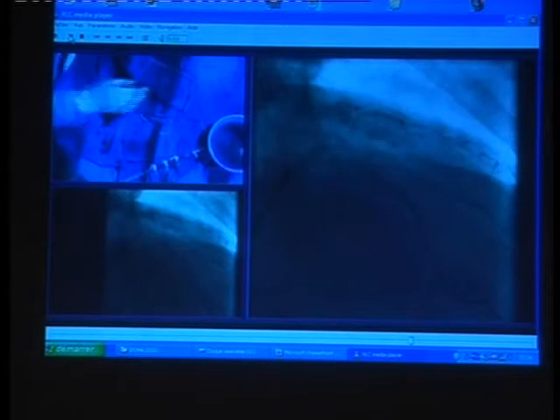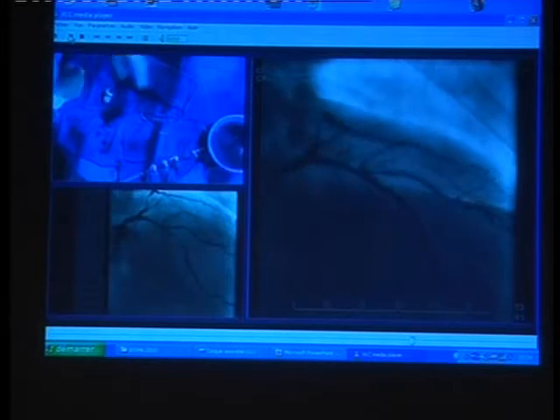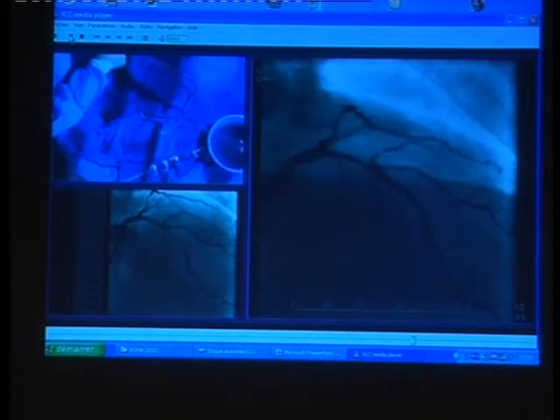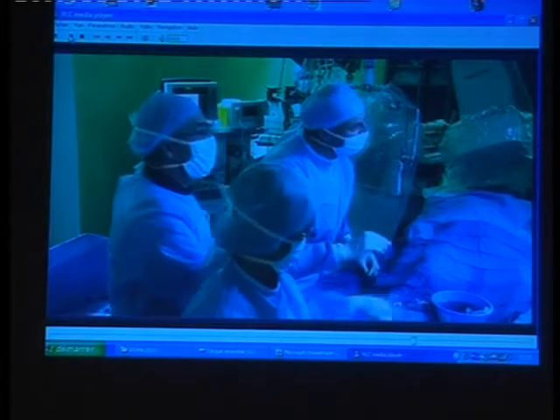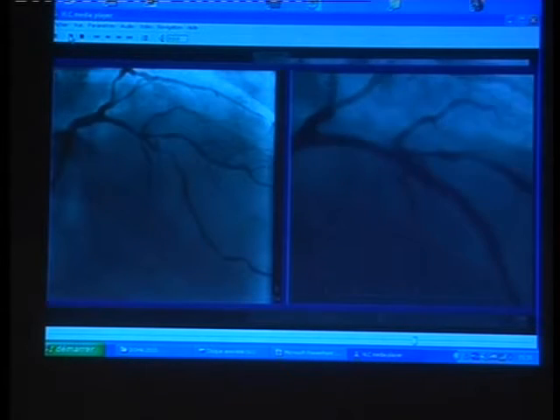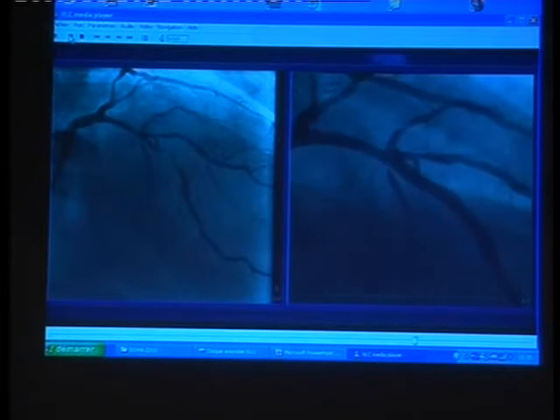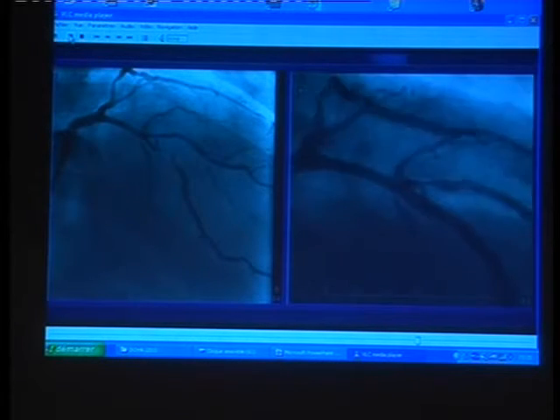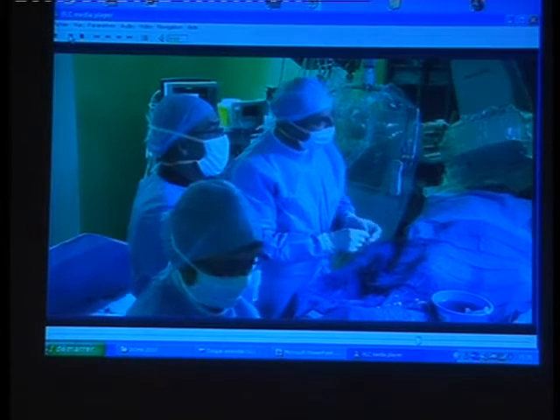Yeah, that's not bad. You can zoom on the proximal part of the stent. Probably an additional inflation will be necessary. Even at the mid part of the stent, just after the bend, it seems that maybe there is something also at this part. But the crucial thing here will be to be careful and accurate.